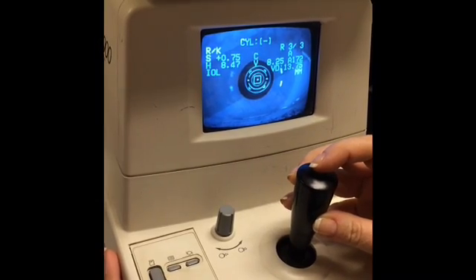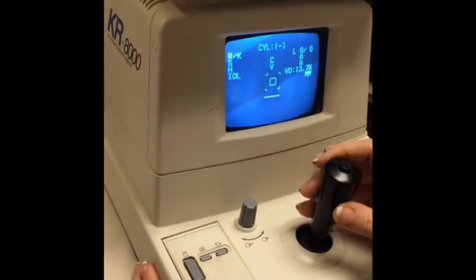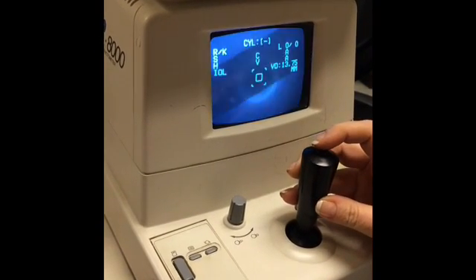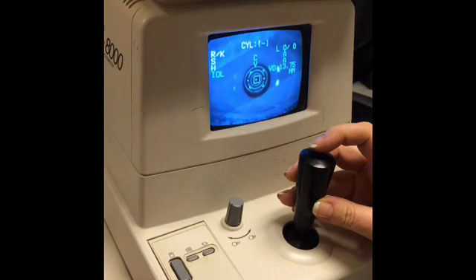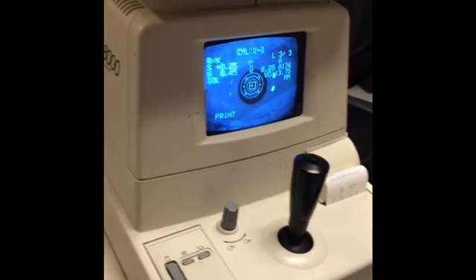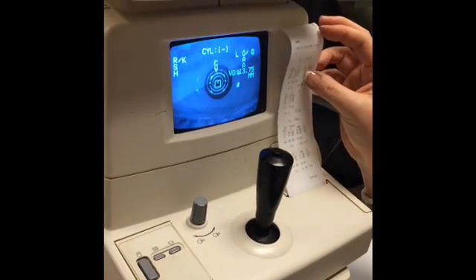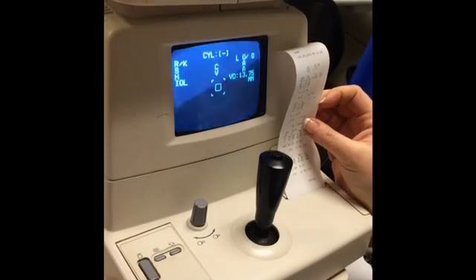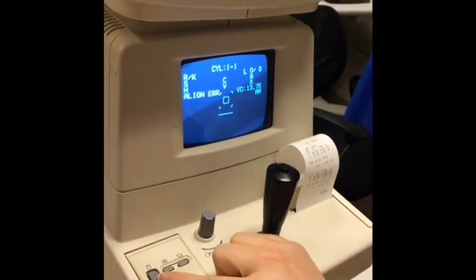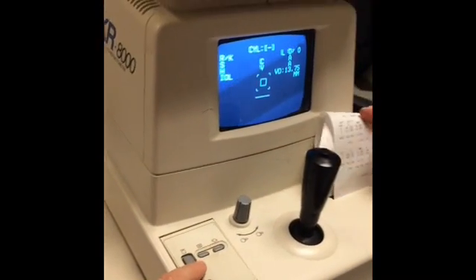After obtaining three measurements with the AR, move to the other eye and repeat the process, moving in slowly until the mires clear, obtaining three measurements and print. The AR will automatically print if all three measurements have been attained automatically. If it does not print, simply hit the print button to the left-hand side of the platform.